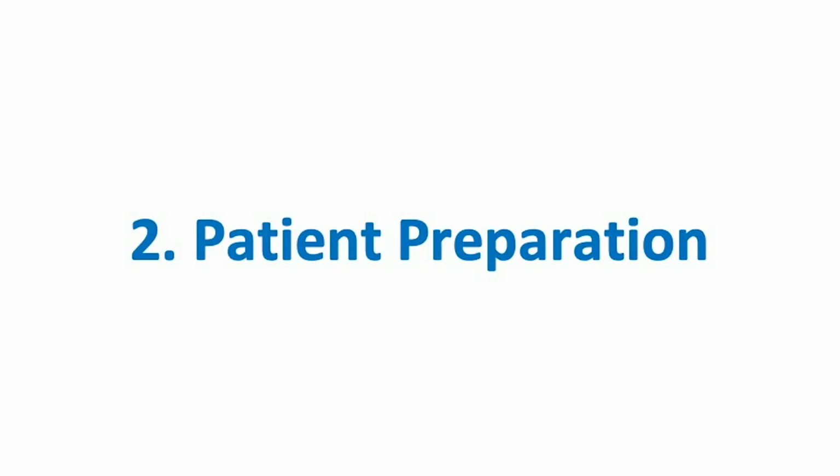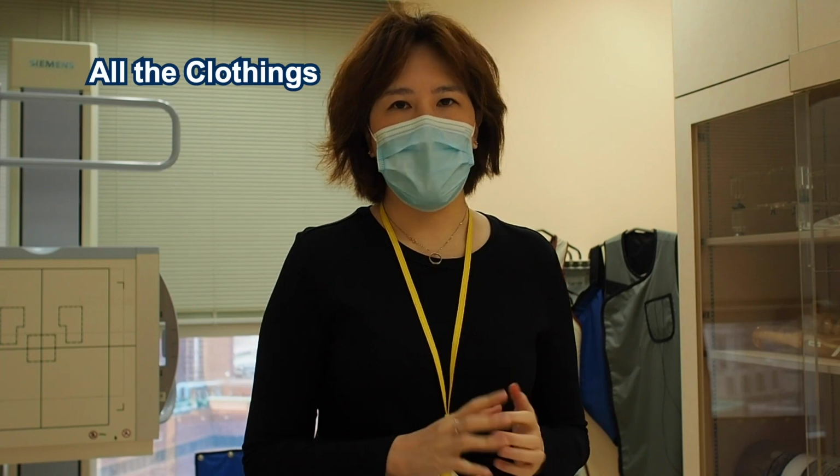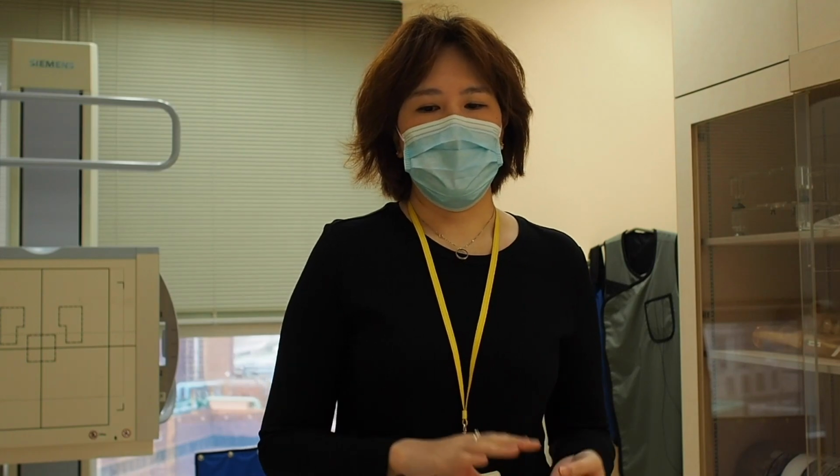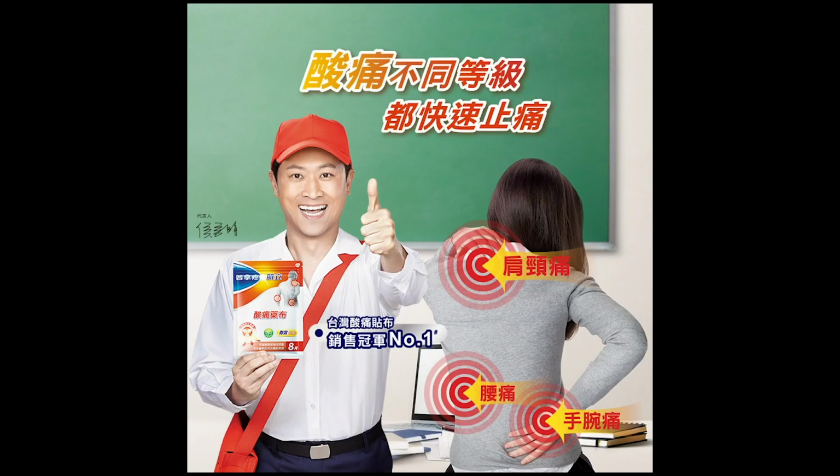Patient preparation. Patients are required to change for certain examinations. The basic principle is to remove all the clothing and artifacts or accessories that will cause artifact on your image. Basically, it depends on what region that you're going to take. Things like necklace, bracelet, and then ring or transdermal patch has to be removed if it is in your region of interest.